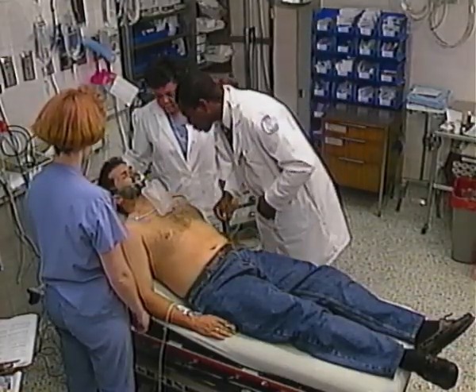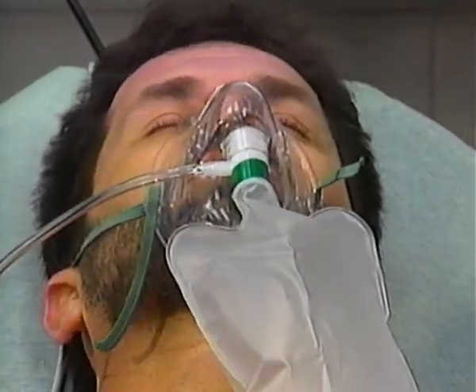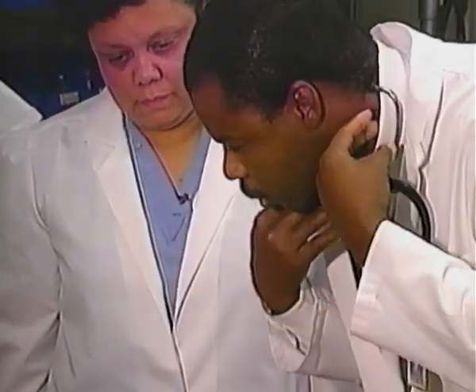Mr. Jackson, I'm Dr. Parker. How are you doing, sir? Do you have heart disease, sir? Do you have any allergies? He's getting out of it. I'm going to go ahead and listen to his chest.